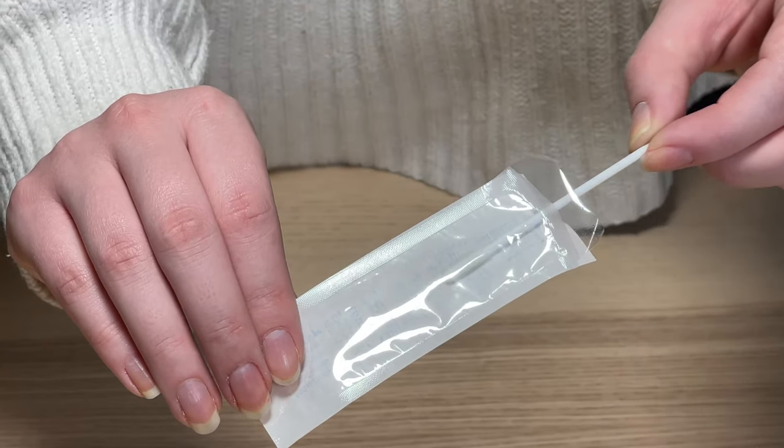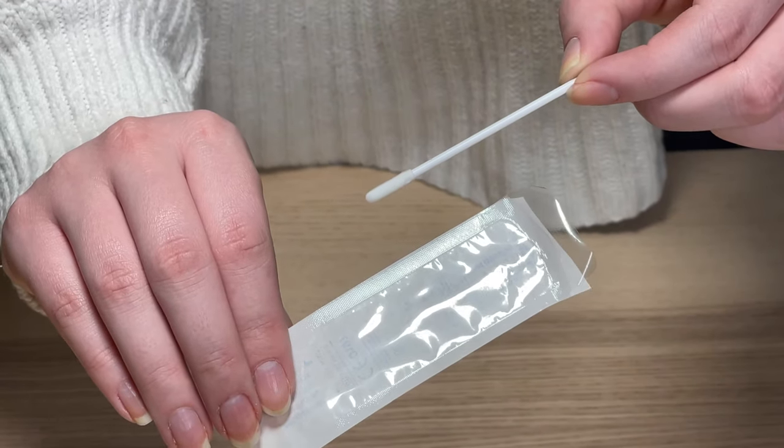Open the swab packaging on the stick end and take it out. Be careful not to touch the nasal swab end. Gently insert the entire absorbent tip of the swab, only half an inch to three quarters of an inch, into one nostril.